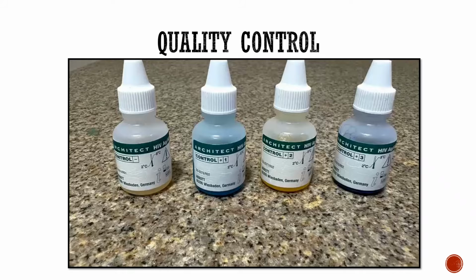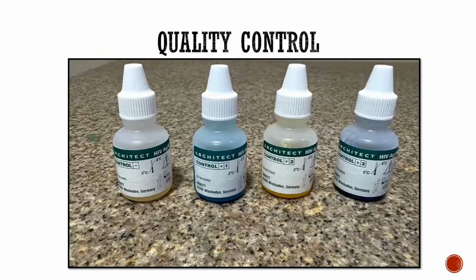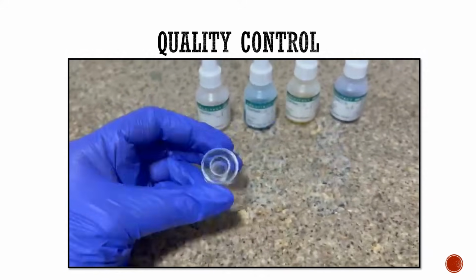The recommended quality control of the analyzer is that each control, that is the positive and negative control provided by the manufacturer, should be tested once in every 24 hours, and the control values must be within the range specified in each control package insert. So for example, for HIV, these are the positive and negative controls provided.